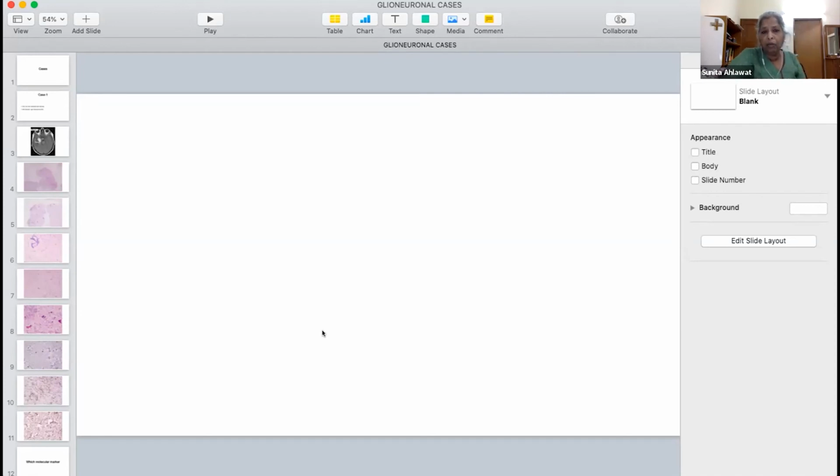I had taken out all types. And neurocytomas, gangliogliomas are commonly seen. And Gaurav, we have seen 2 or 3 cases of papillary glioneuronal tumor. Yes, ma'am. We have seen 2 cases of papillary glioneuronal tumor and one rosette forming glioneuronal tumor. And one leptomeningeal glioneuronal tumor I saw before Gaurav joined us.